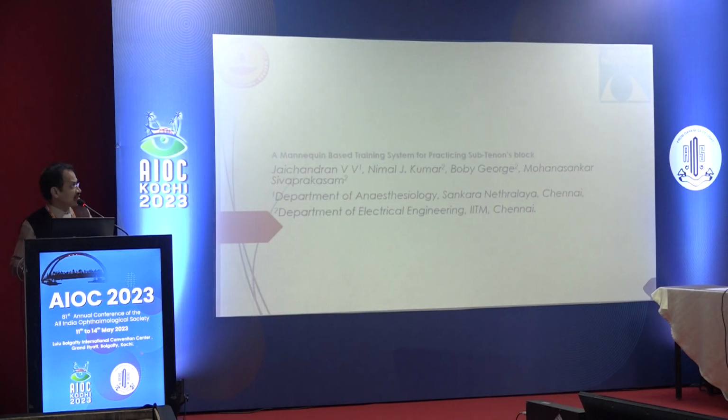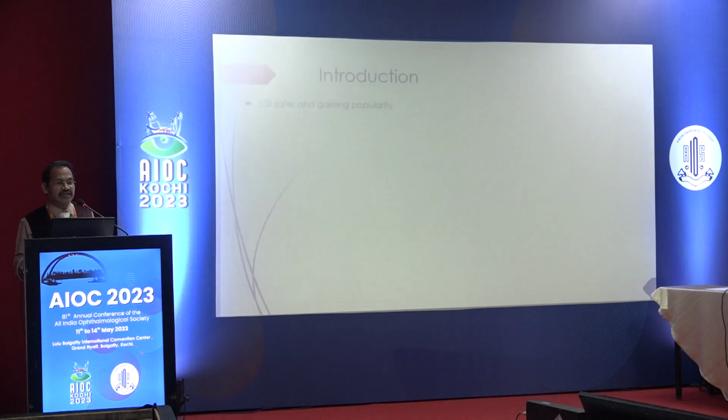Now, the second simulator which we developed was the subtenons simulator. This was a real challenge for us because unlike needle block, here the participants have to make a nick in the simulator. So it is a little bit invasive. So this was a real challenge for us, but fortunately we were able to do it.